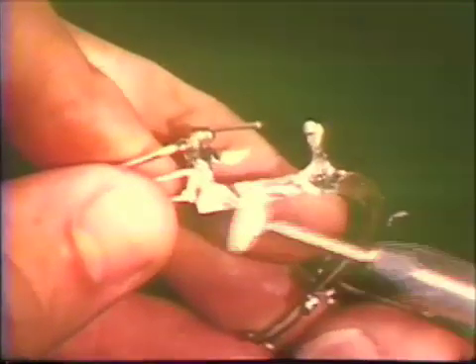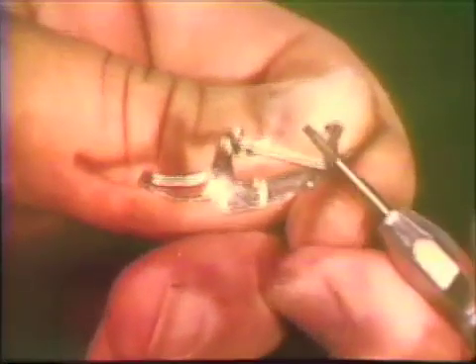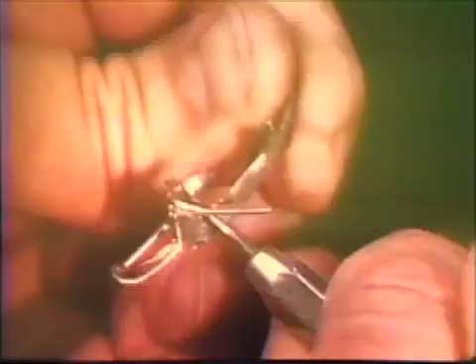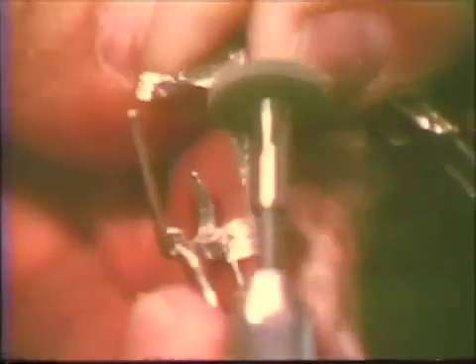Any sharp edges of the lingual bar are reduced. The superior border of the major connector is rounded. Minor connectors are cut back to more adequately conform with the anatomy involved. When proper reductions have been made, a suitable abrasive polishing instrument is used to provide the desired smooth finish.